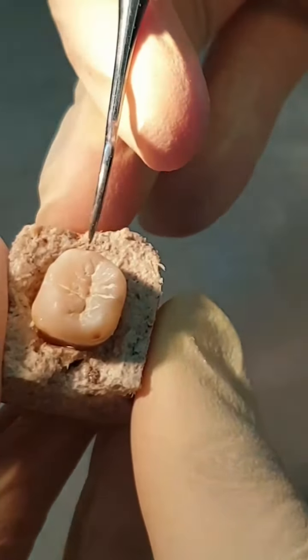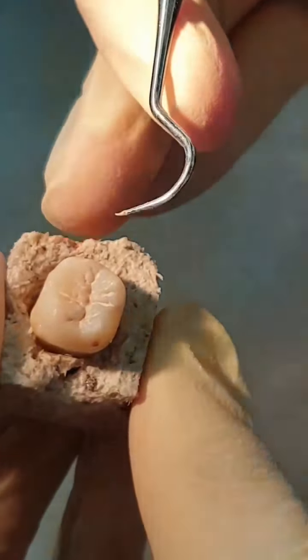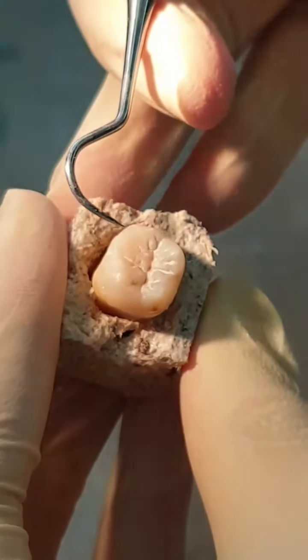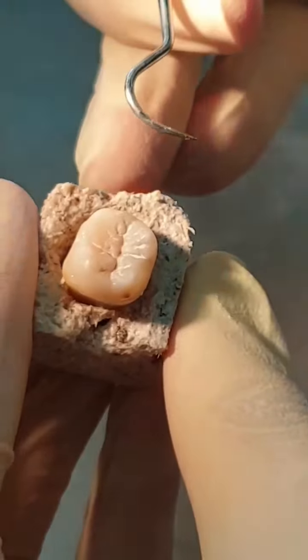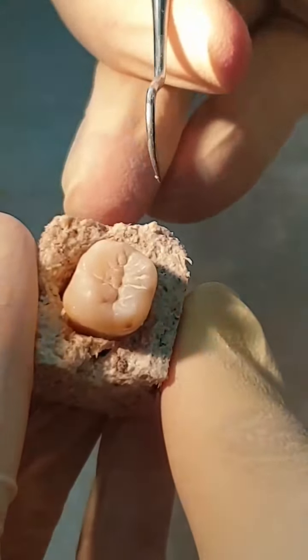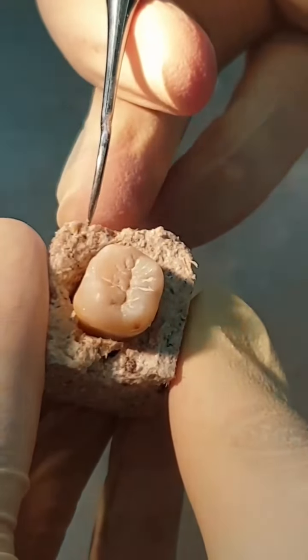Hello everyone, today we are going to show you mandibular first molar access cavity. As you can see, we mounted our tooth in a block. As we know, this tooth has two roots, mesial and distal, and in each root we can find two or more canals.